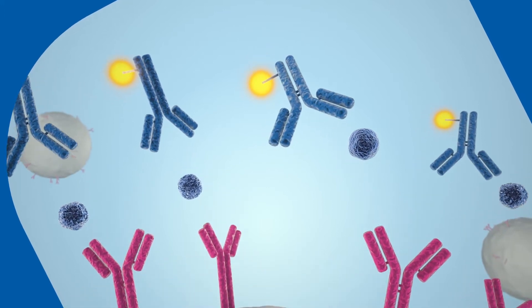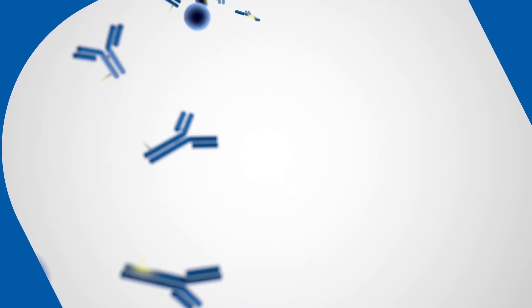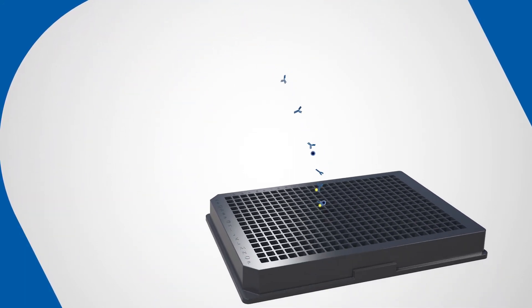After washing to remove unbound proteins and nonspecific material, the complex is disassociated, the beads are magnetically separated, and the final eluate is transferred into the final reading plate.